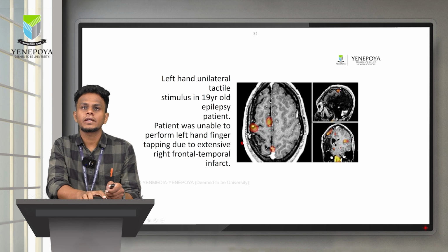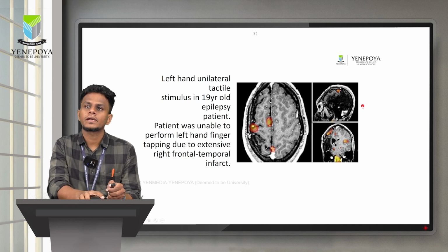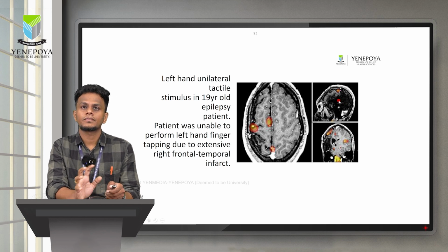So this is a case of a 19-year-old epilepsy patient. Here you can see the patient was unable to do left hand finger tapping because of an extensive right frontal temporal infarct. Here you can see the infarcted area in the MRI. There is no activity, so the patient couldn't perform.